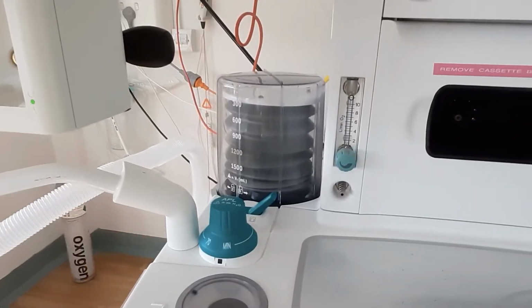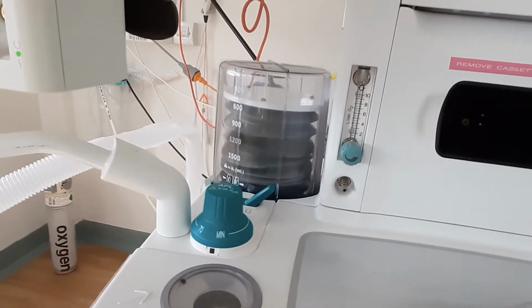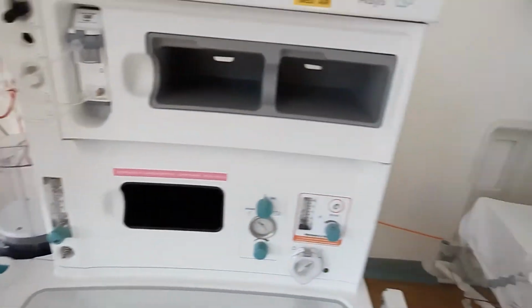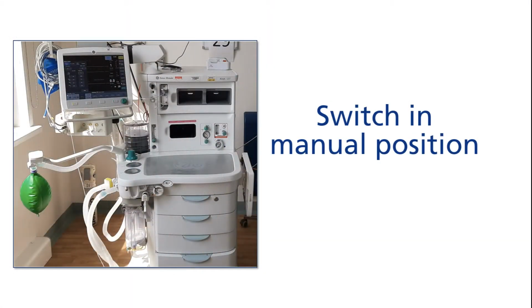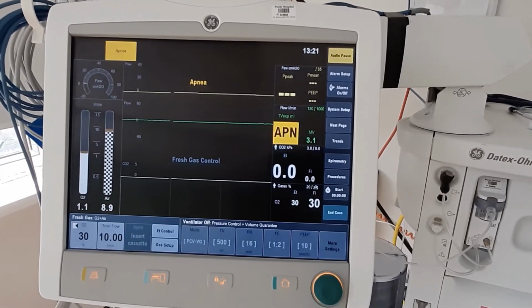If this was a COVID-19 positive patient, you would first of all turn off the ventilator to prevent any spray, and then you would look at your patient before checking over the circuit to find and fix the leak. The reason for the patient's chest not moving could be that the switch is set in the manual rather than the ventilation position.